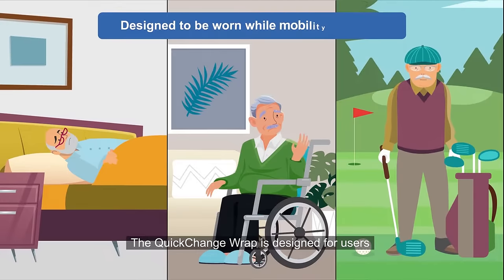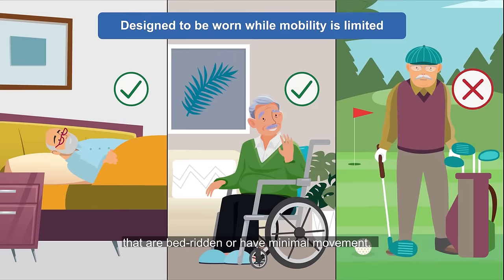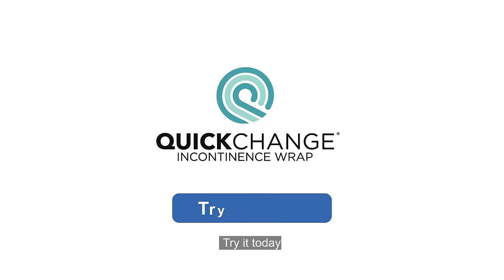The Quick Change Wrap is designed for users that are bedridden or have minimal movement. Try it today!